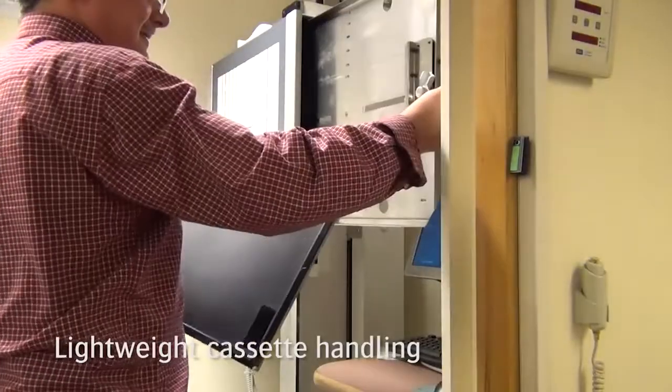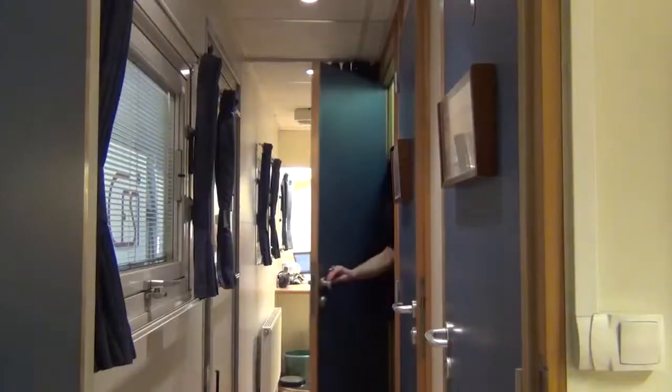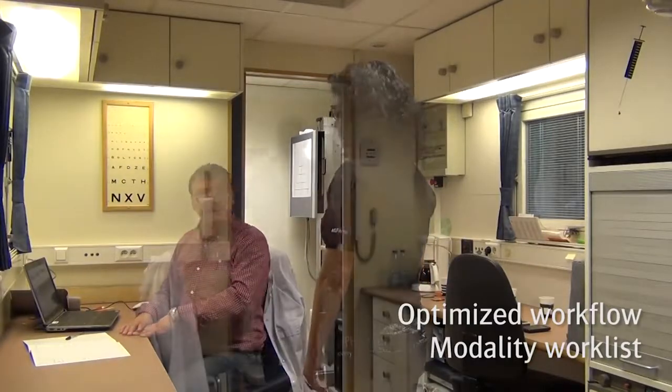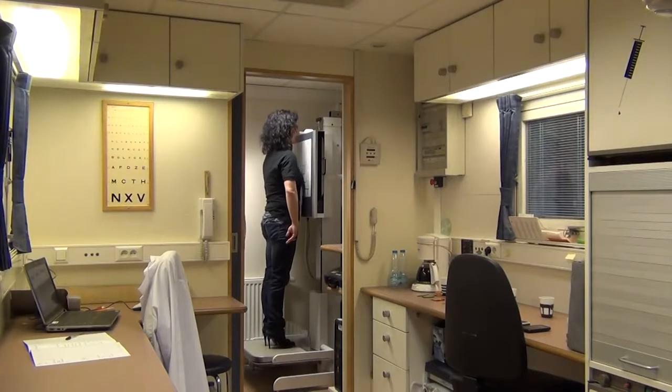The lightweight cassette needs to be inserted into the Bucky. In mobile environments, the workflow can be optimized by using the Modality Worklist option to have the patient automatically prepared on the NX workstation.